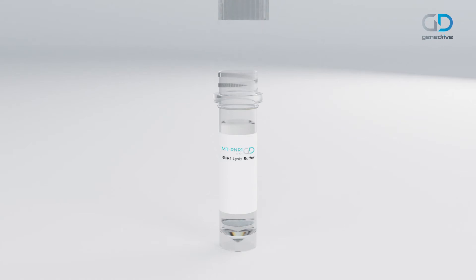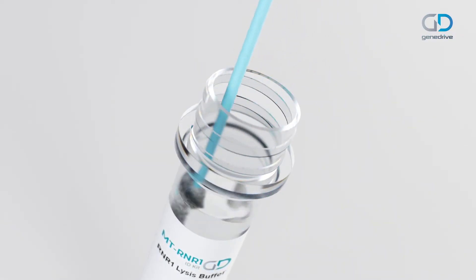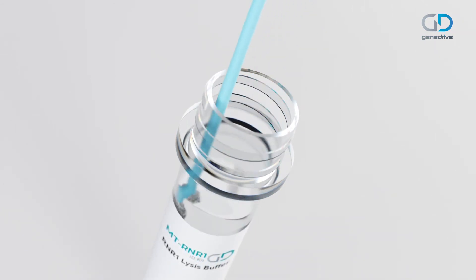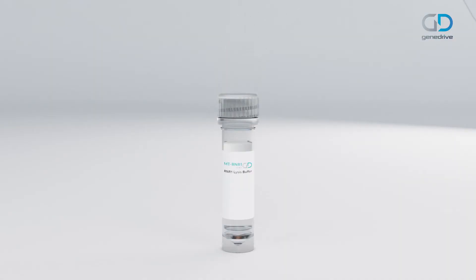Open the GeneDrive lysis buffer tube. Submerge the buccal swab tip and rotate the swab for 30 seconds to release the buccal cells into the solution. Remove the swab from the tube and discard. Securely replace the buffer tube lid.